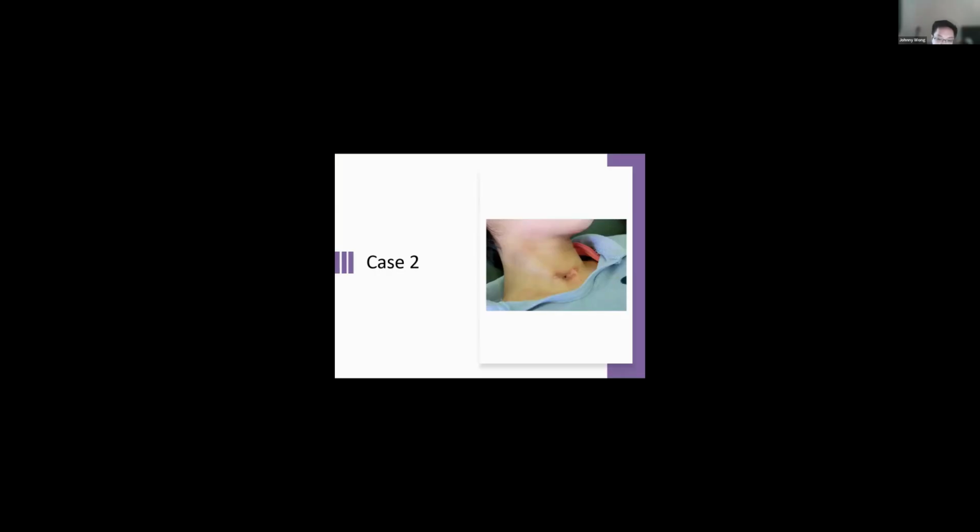Moving on to a second case. The patient has had this trach for years. He frequently changes it on his own, but this time he took it out and wasn't able to put it back in. If you think about what complication may cause this, yeah, some sort of stenosis. So this is more of a late complication finding.